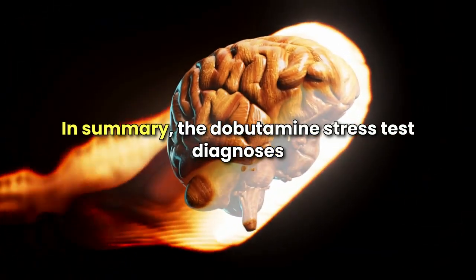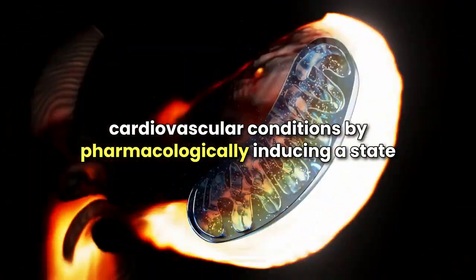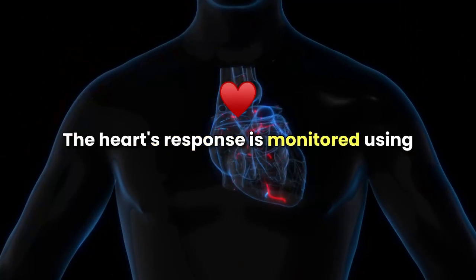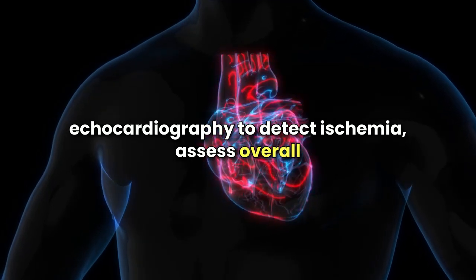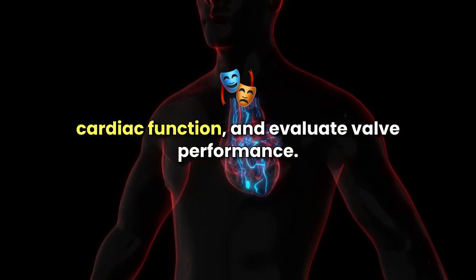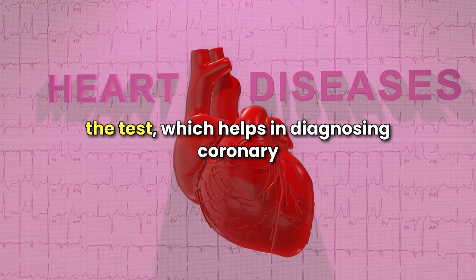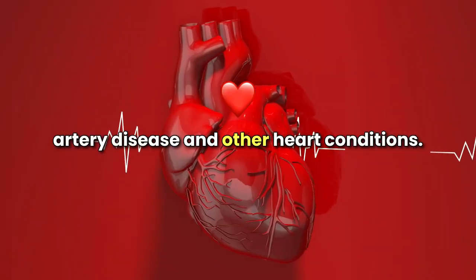In summary, the dobutamine stress test diagnoses cardiovascular conditions by pharmacologically inducing a state of increased heart rate and contractility, simulating exercise. The heart's response is monitored using echocardiography to detect ischemia, assess overall cardiac function, and evaluate valve performance. The presence of ischemia is indicated by new or worsening wall motion abnormalities during the test, which helps in diagnosing coronary artery disease and other heart conditions.